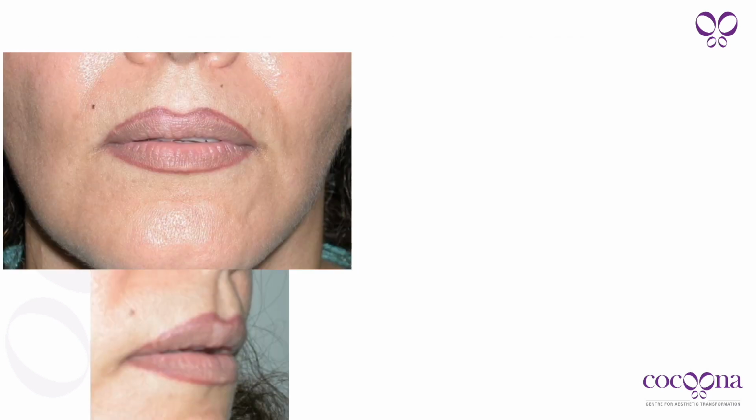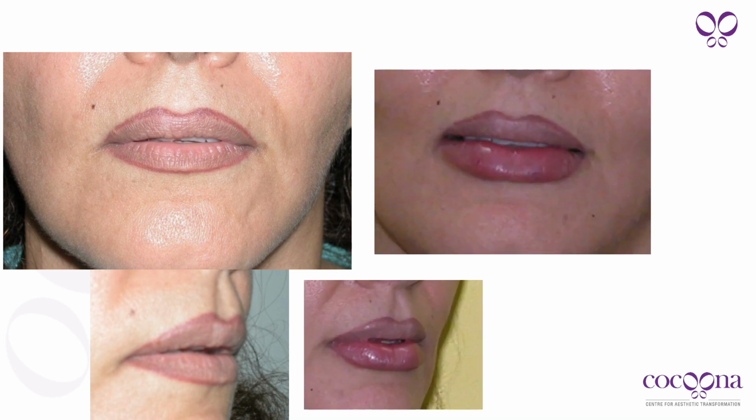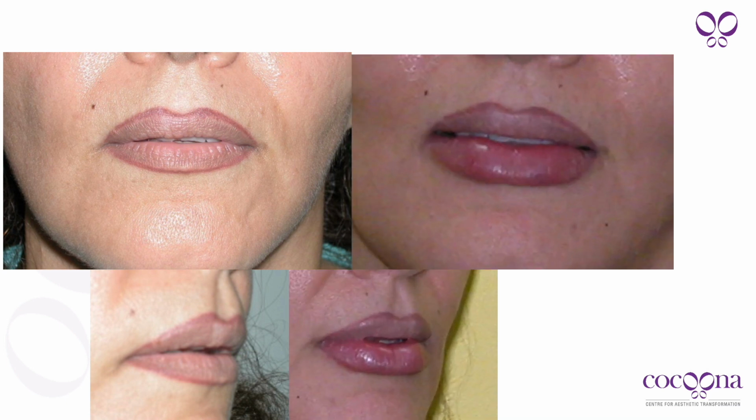This patient already has an enhanced white roll using a tattoo, and of course she has aging mucosa, but the volume is pretty good. So again, the filler is used for contouring and for enhancement of the mucosa, and I have injected more in the lower lip than in the upper lip.